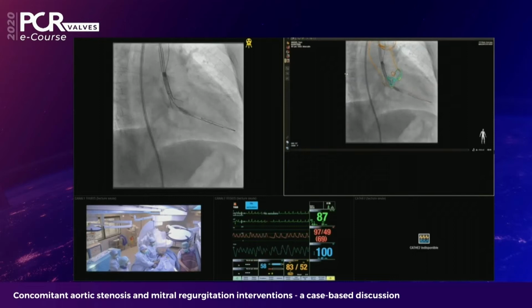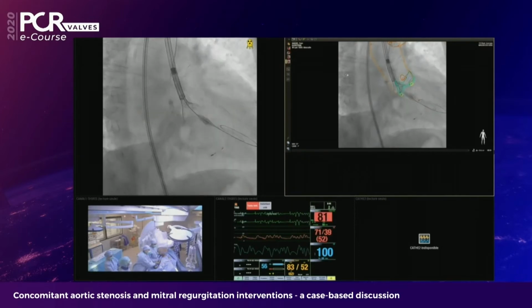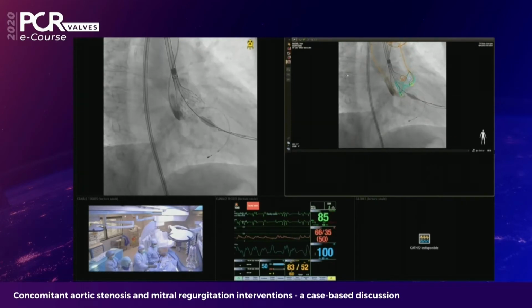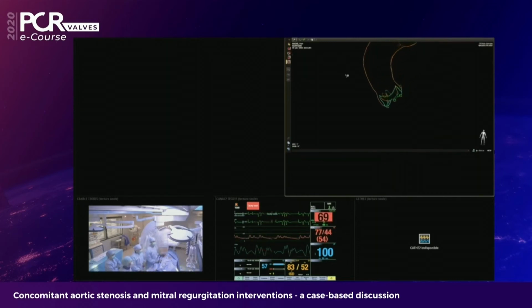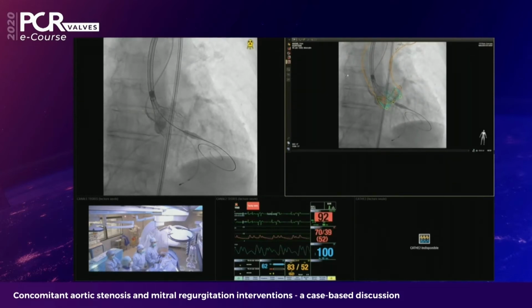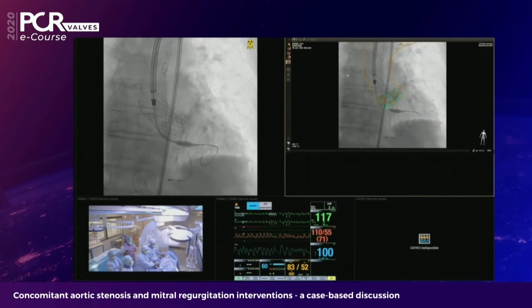Here you see on the left on the screen the yellow dot for the non-coronary leaflet, and on the right the 2 other yellow points which are overlapped for the other leaflets. In this C-arm orientation you cannot have any parallax problem, and what you see is the real depth of implantation of your prosthesis in the LVOT, whatever the cranial caudal orientation you add to your C-arm. So when you are happy with the result, you can deliver the valve here back in LAO, and when the valve is completely deployed, you just have to do your check.